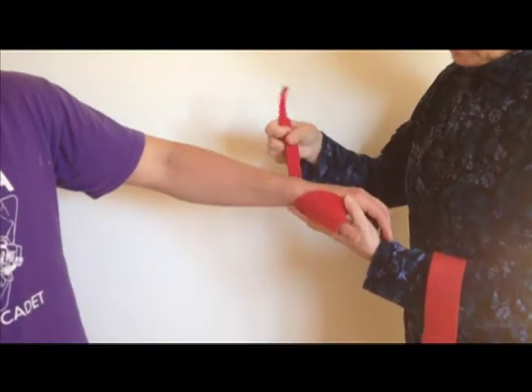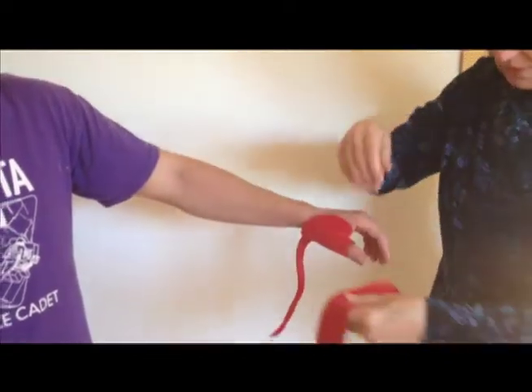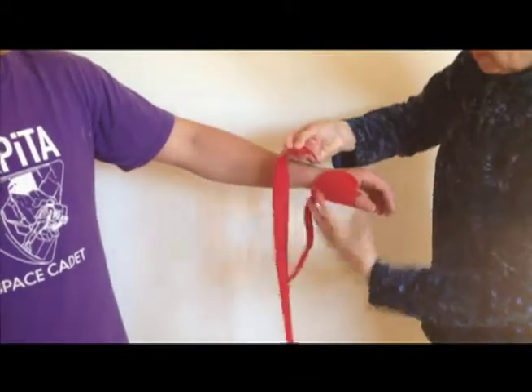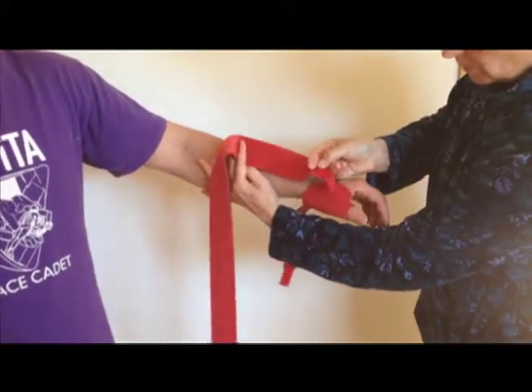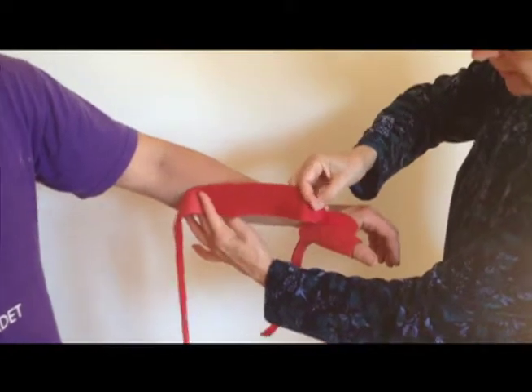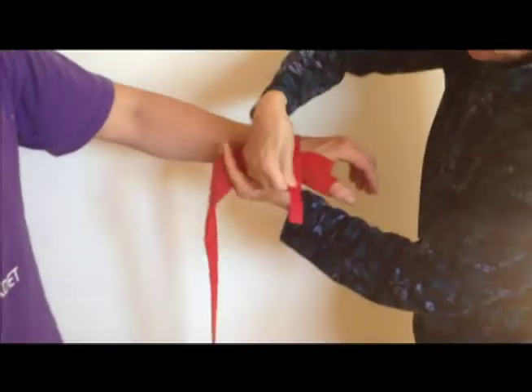I've got the thumb splint on comfortably, and I'm going to attach the narrow end of the supinator strap. Instead of going in alignment with the thumb, I'm going to follow the line of the edge of the splint and reattach the thumb splint.